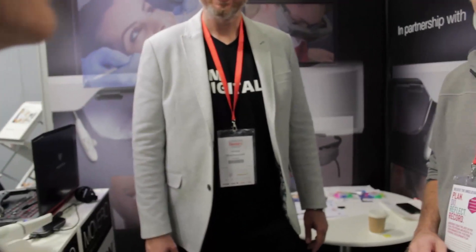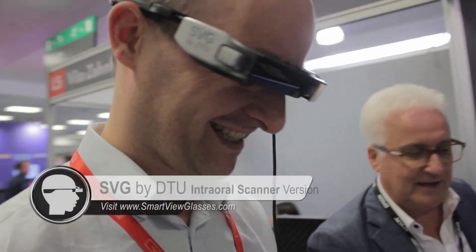You are welcome to be here at Epson's and DTU stands. I would like to know what you think about the product and the experience you have. So for me it's something quite interesting, for sure for patients — it depends on the dentist.